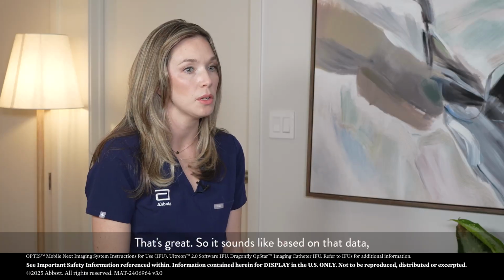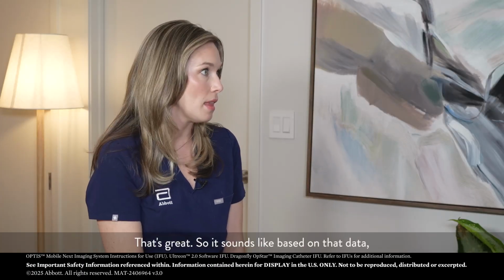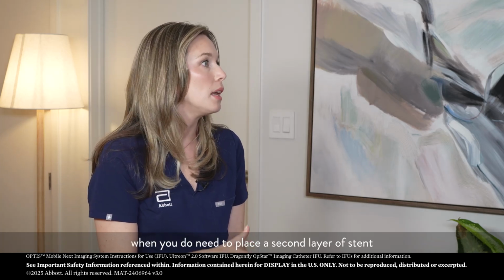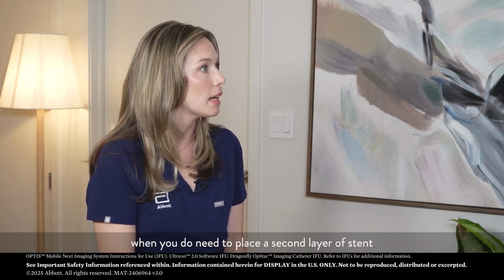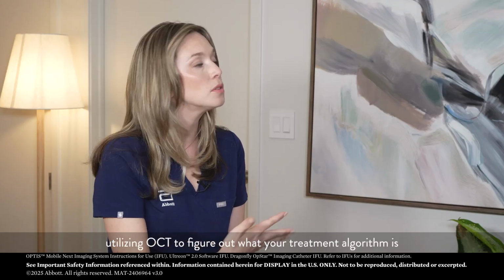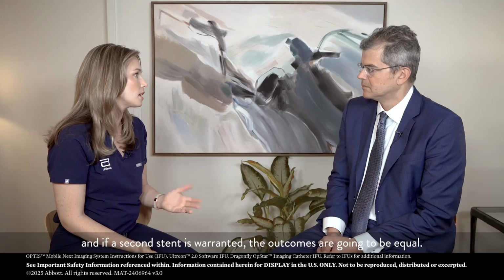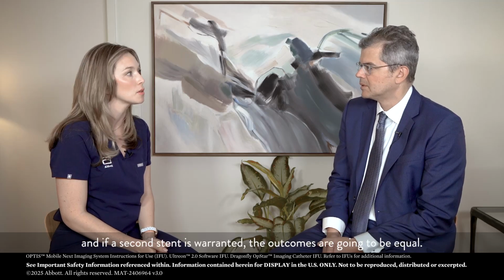That's great. So, it sounds like based on that data, then you can be confident in a situation when you do need to place a second layer of stent, utilizing OCT to figure out what your treatment algorithm is, and if a second stent's warranted, the outcomes are going to be equal.